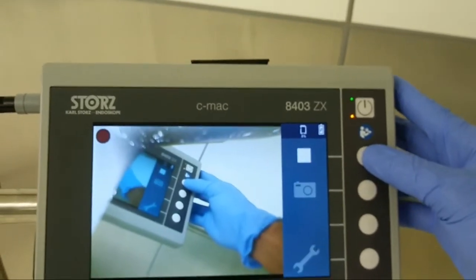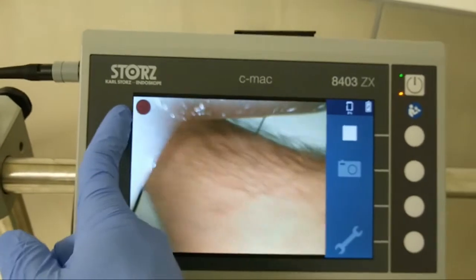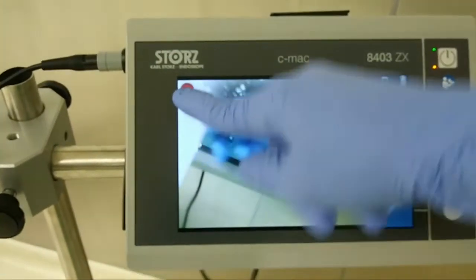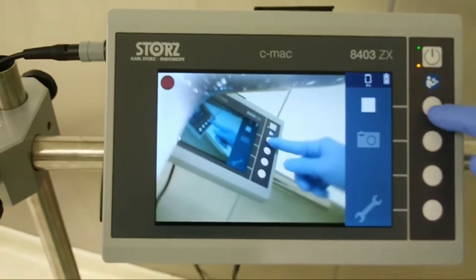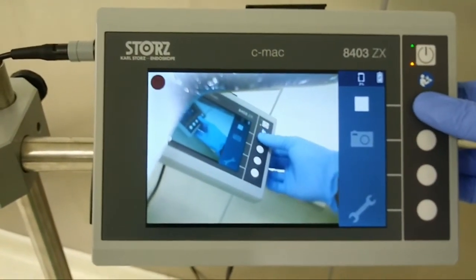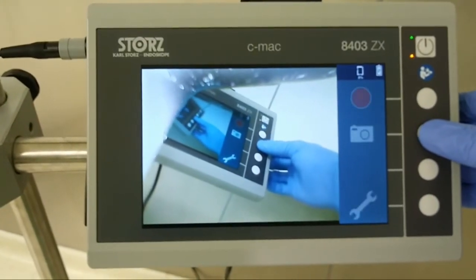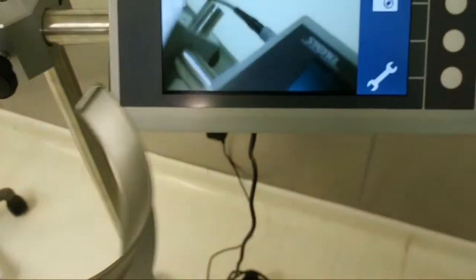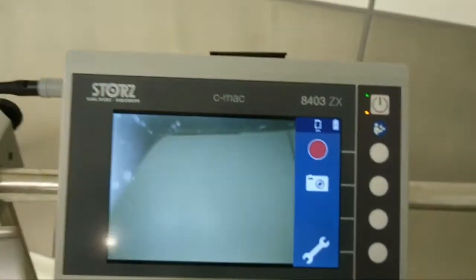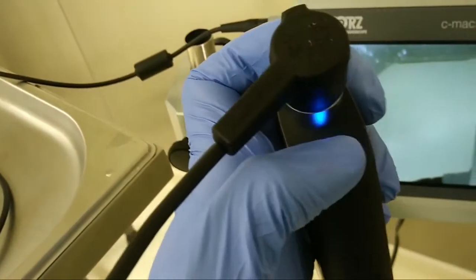This is the technique to capture videos and photos through the monitor. Just press it. That's it. You can also take photos like this. And we can adjust the brightness and video clarity also.